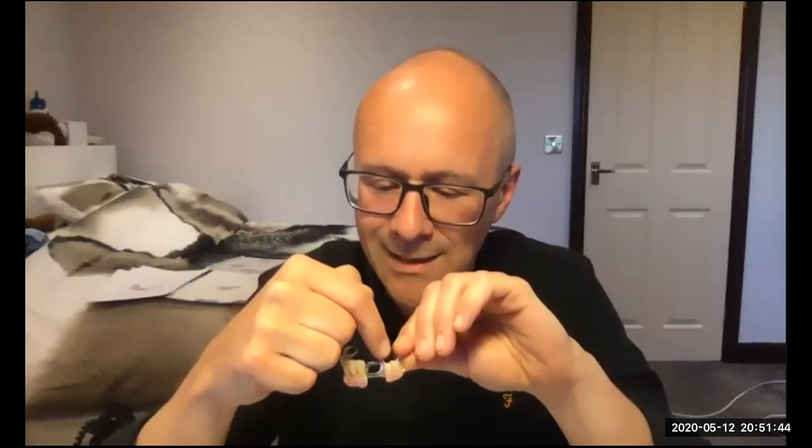So that's that. Now for doing a crown inside, it's more tricky. How I would do that is I would prepare the tooth for a crown first, and then I would fit the denture in place. And then where the metalwork of the denture fits against, or would fit against, the crown, I put in Duralay pattern resin or GC pattern resin. So I do it with a powder and liquid onto the preparation and gently build that up. So it then touches the inside of the frame itself, just on that part where the denture would touch the tooth. And then what I would do is a crown and bridge impression with the denture in situ and take that out. So then the technician has got that exact border, but also an impression of the prepared tooth. It's not easy doing it though, Maria.